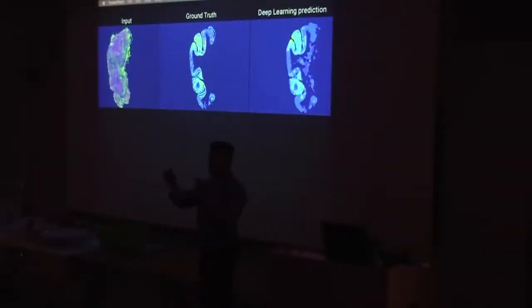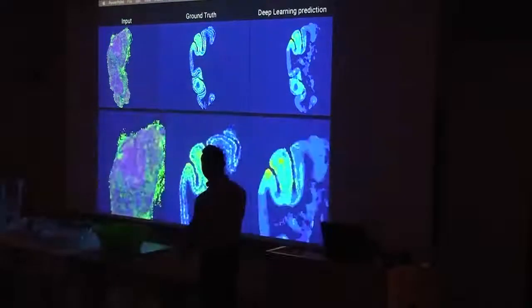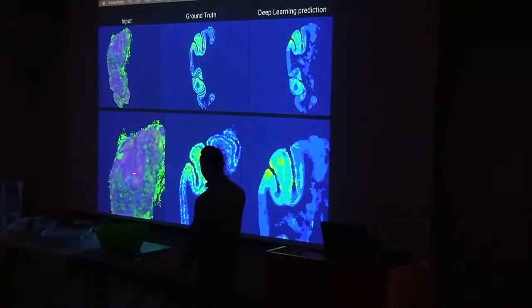All right. So when I put everything together, so I used, again, 28 by 28 patches, and then I put everything together to try to get a prediction per slice. And then I obtained these beautiful images. So you can see here the MRI, and this is the ground truth. And you can see here how the network really does a good job predicting these regions. So I'm showing you the best examples that I got.